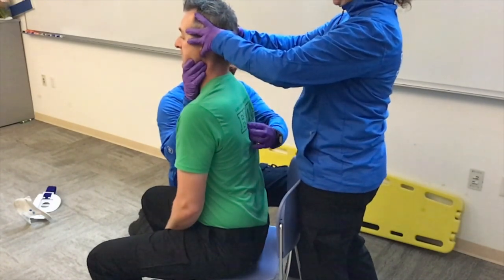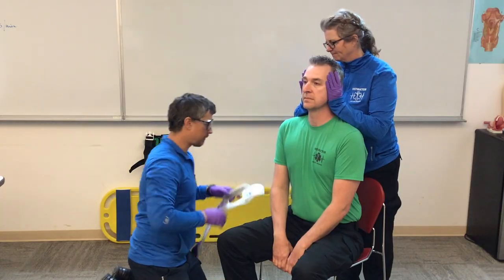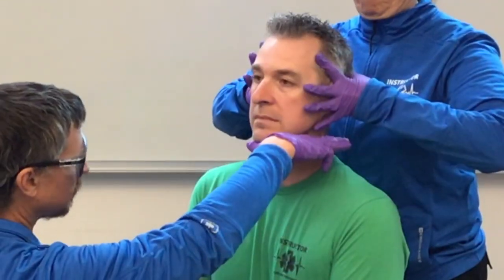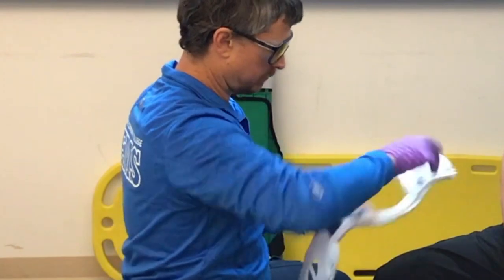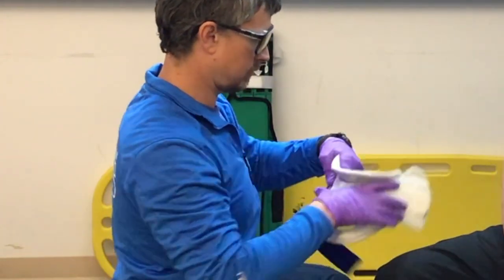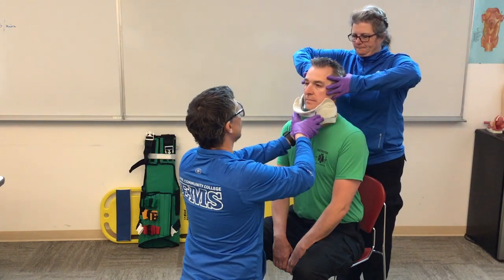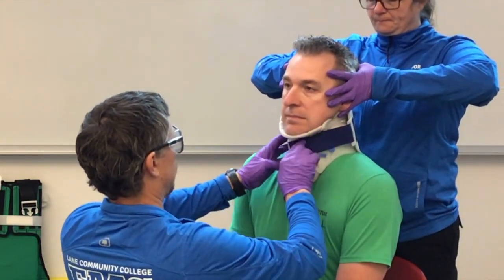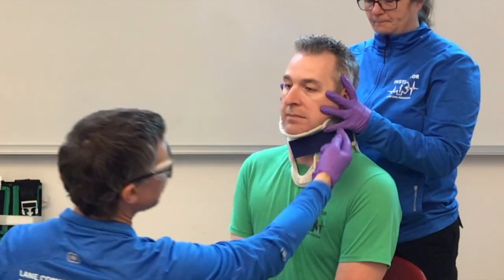Checking in: does anything hurt? No. Then I'm going to apply my C-collar — measure it, apply it. Check that it's straight, not too big a gap, and that it sits on the traps. Make sure the ears aren't trapped.